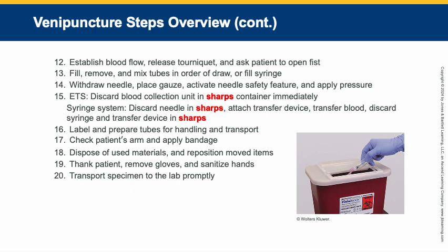If you have the tourniquet on and it has not been longer than a minute, okay, when we've started, then you're going to fill the tubes in the order of draw. And then when you get to the last tube, then pop the tourniquet at that time. But if you've had that tourniquet on them for a long time, then yes, you need to release it first, in that order, okay? Because then you've had that tourniquet on so long that there's going to be a problem with the specimen, like hemoconcentration.